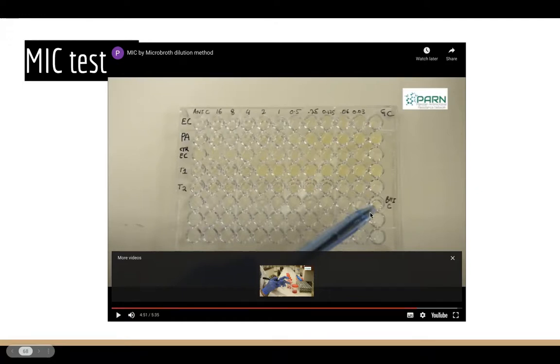You can see the quality control here. This is where the bacteria have grown to their fullest, and you can see the MIC. So you take the MIC where you've got no growth, and also like half growth. You can note it down as you'd like, but as long as you keep it to controlled standards of no growth.